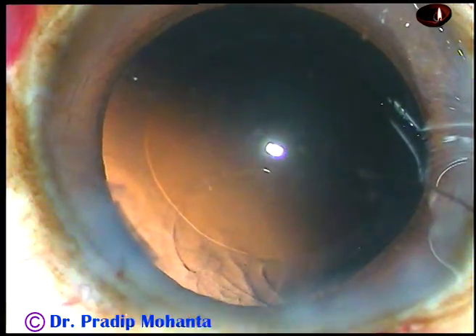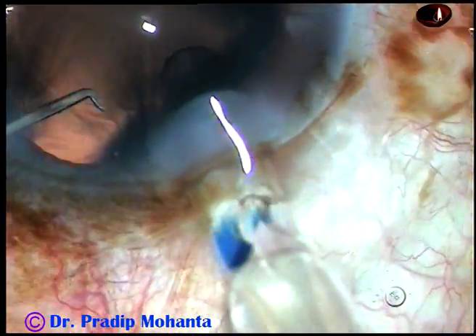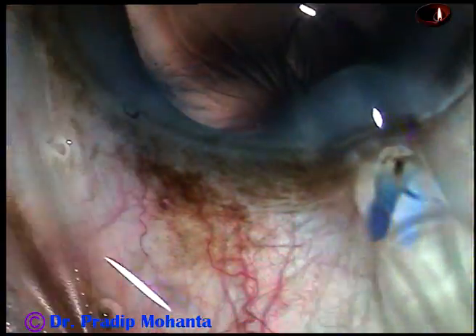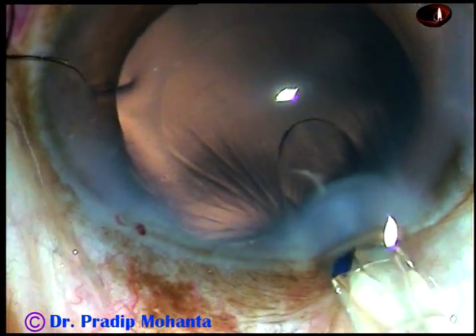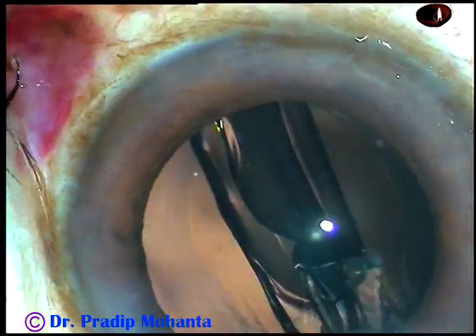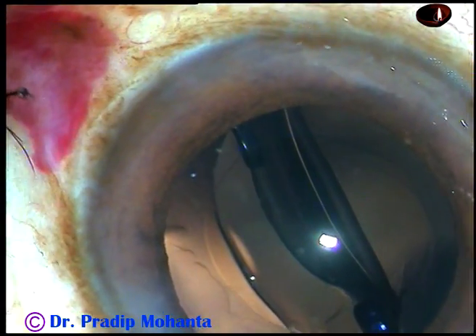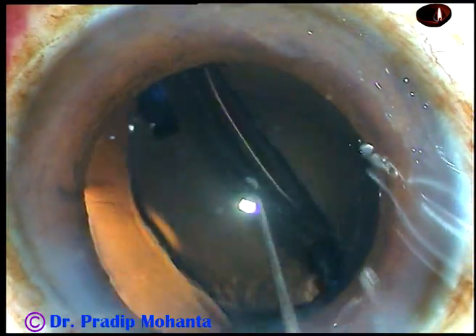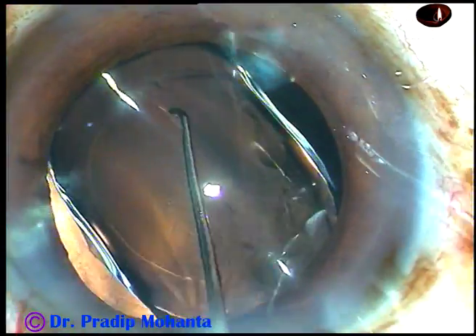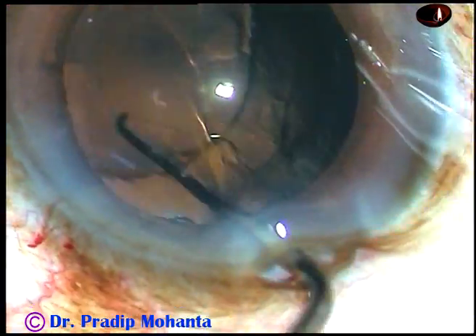Now 2% HPMC is injected again. And now this is a non-aspheric foldable monofocal intraocular lens. The leading haptic goes into the capsular bag and the trailing haptic has also gone into the capsular bag. If we can hook the rhexis margin with a Szynski hook, it indicates the lens is in the bag.